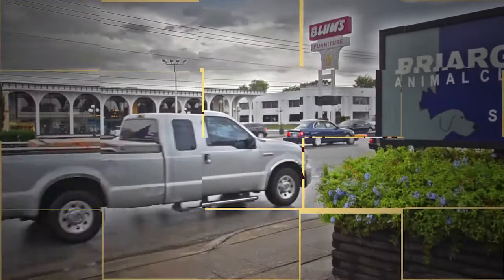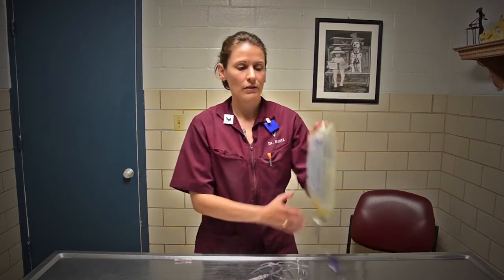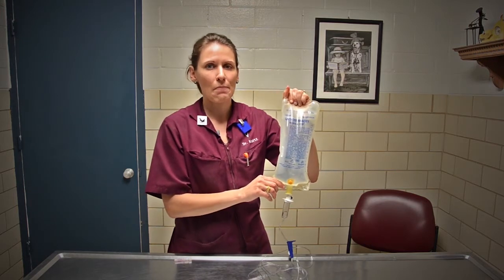So we teach many owners how to administer subcu fluids to their animals. Subcu fluids are generally administered for animals who have chronic kidney disease. Each time you refill your fluids, you should receive a bag that looks very much like this. This is a 1,000 ml bag.